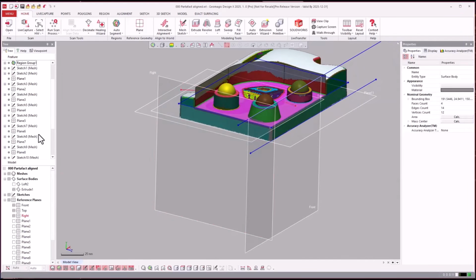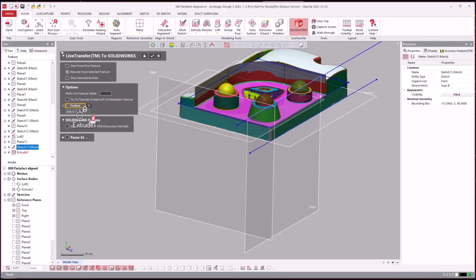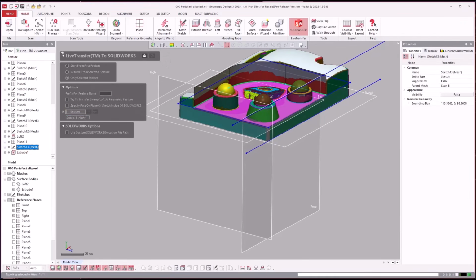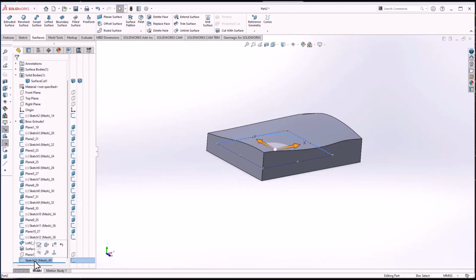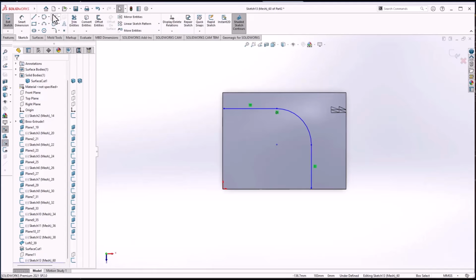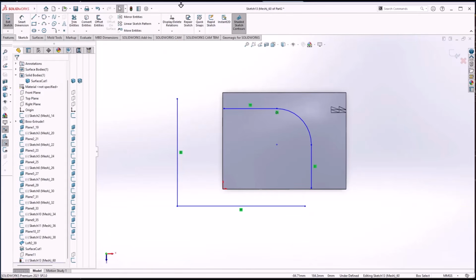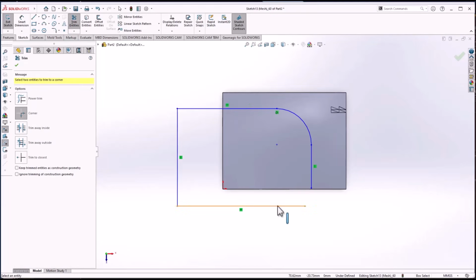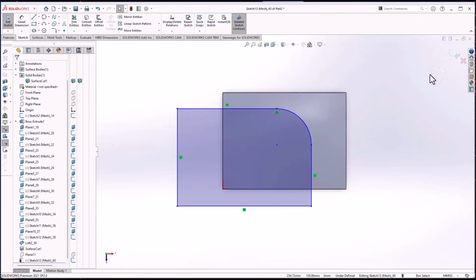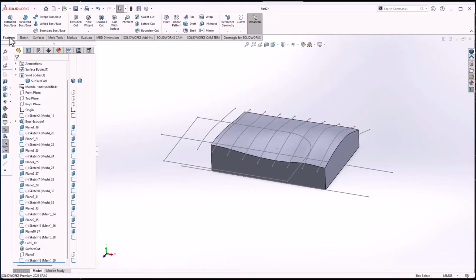So it fit it as a surface. Now I don't have to send it as a surface. What I can do is I can click this and say SolidWorks send only selected entities. Send. So you see here that it sent this. Now I can just come in here. Again, you're asking yourself, why is he doing it this way? There are instances where if you're trying to do a very complicated model where you know that some of the stuff, the way it's going to translate over with live transfer is going to be a little challenging, you can do it this way, where you model as you go. That's basically what this is. I'm going to model as I go.